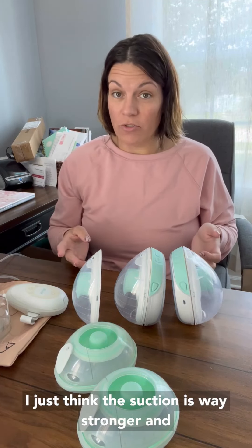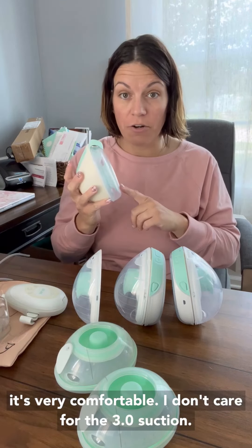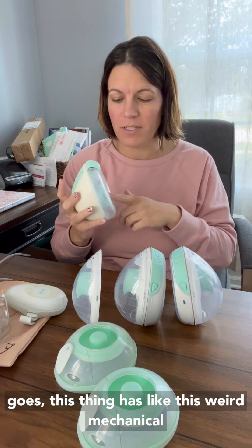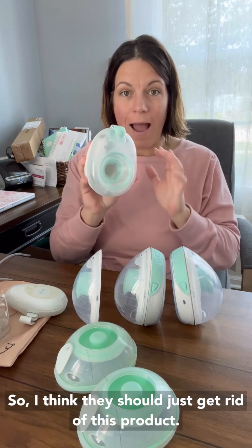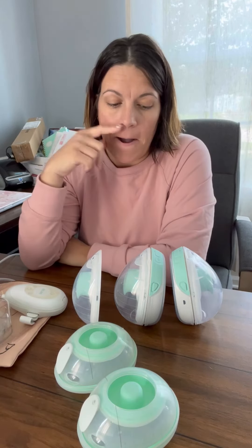Number two, I just think the suction is way stronger and it's very comfortable. I don't care for the 3.0 suction — it's a world of difference. As far as volume goes, this thing has this weird mechanical noise every time it triggers and this does not. So I think they should just get rid of this product and just replace it solely with the Go.